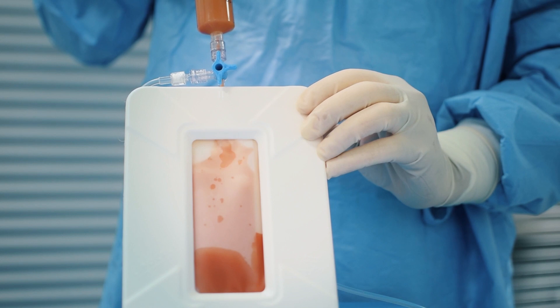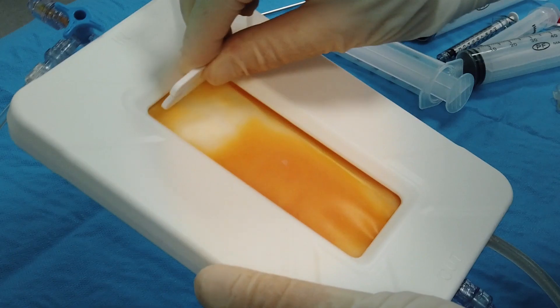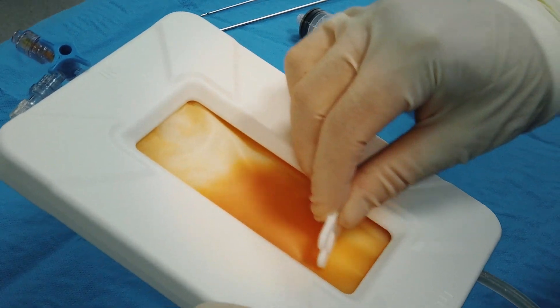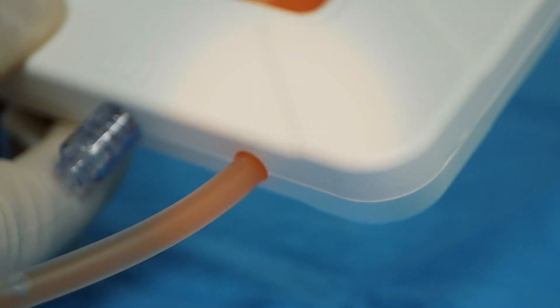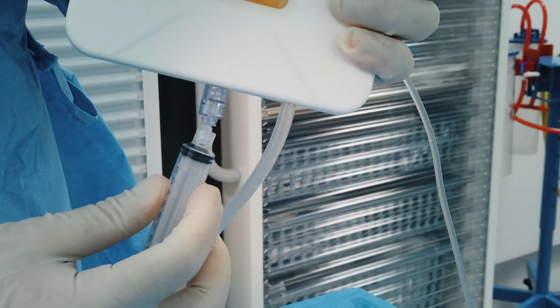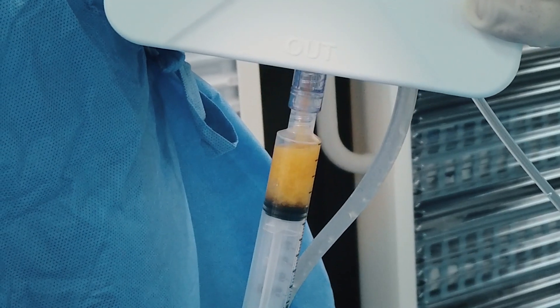Insert the obtained lipoaspirate through the in-luer lock connection. Open the irrigation and facilitate the washing of the tissue with the brush provided within the kit, using gentle movements. Keep on until the tissue becomes yellow and the outflow irrigation is almost transparent. Close the irrigation and remove the excess washing liquid with the help of the brush.